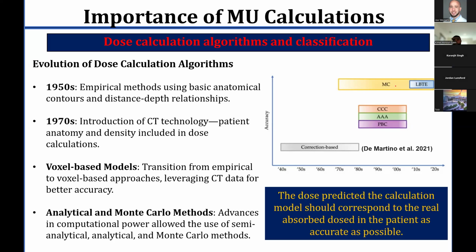If I want to give an example, you have the TAR method, which typically combines beam attenuation as well as scatter effects to approximate the dose, which often ignores many complexities that we now understand, such as tissue heterogeneity in body parts such as the lungs.